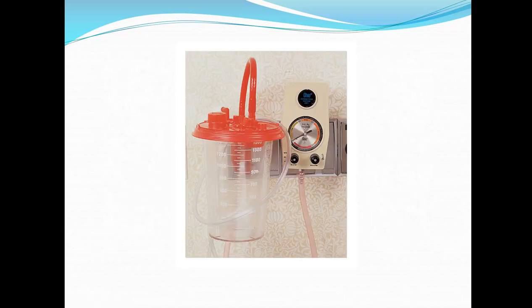This is the wall unit that we were talking about. So you have your meter here, which we would put at 100 to 120 for this type of suctioning. And this is our canister and our suction tubing here.